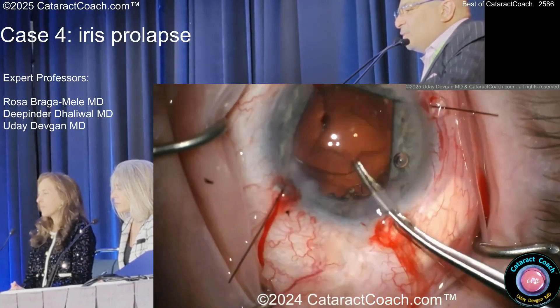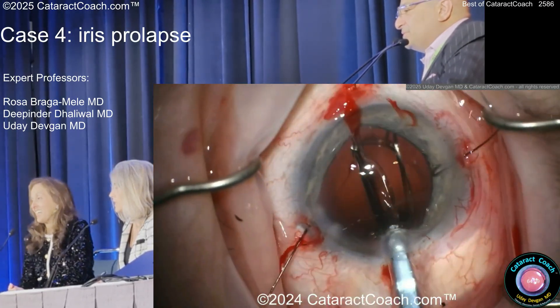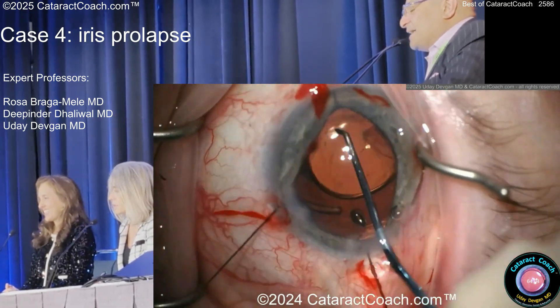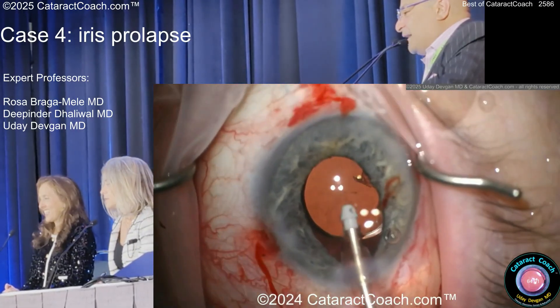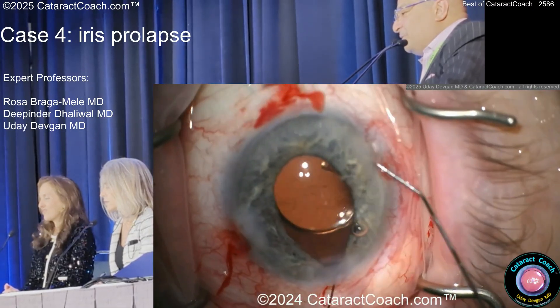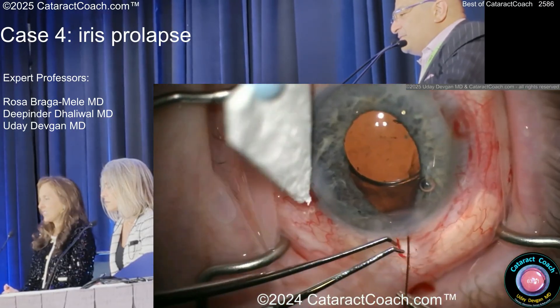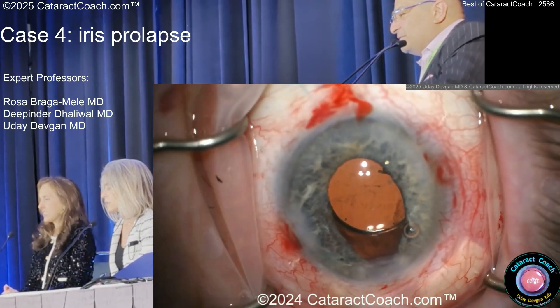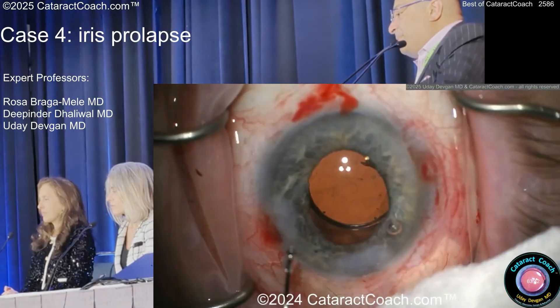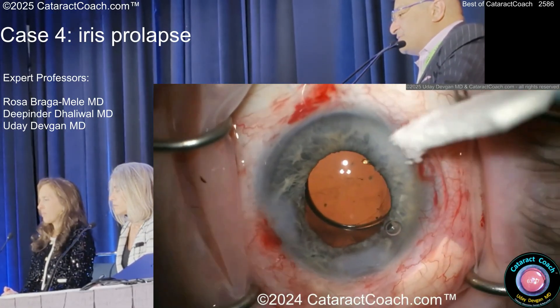The bag's moving a lot — hopefully the CTR is going to go in there okay. I got movie star patients; I can't afford to damage a blue iris. Now it's still prolapsing — what do you want to do? You've got to get it back in the eye somehow. I don't think there's any vitreous, luckily. Maybe a little miochol. I'm putting a suture — I don't need the grief. I don't need to see the iris stuck in the incision.